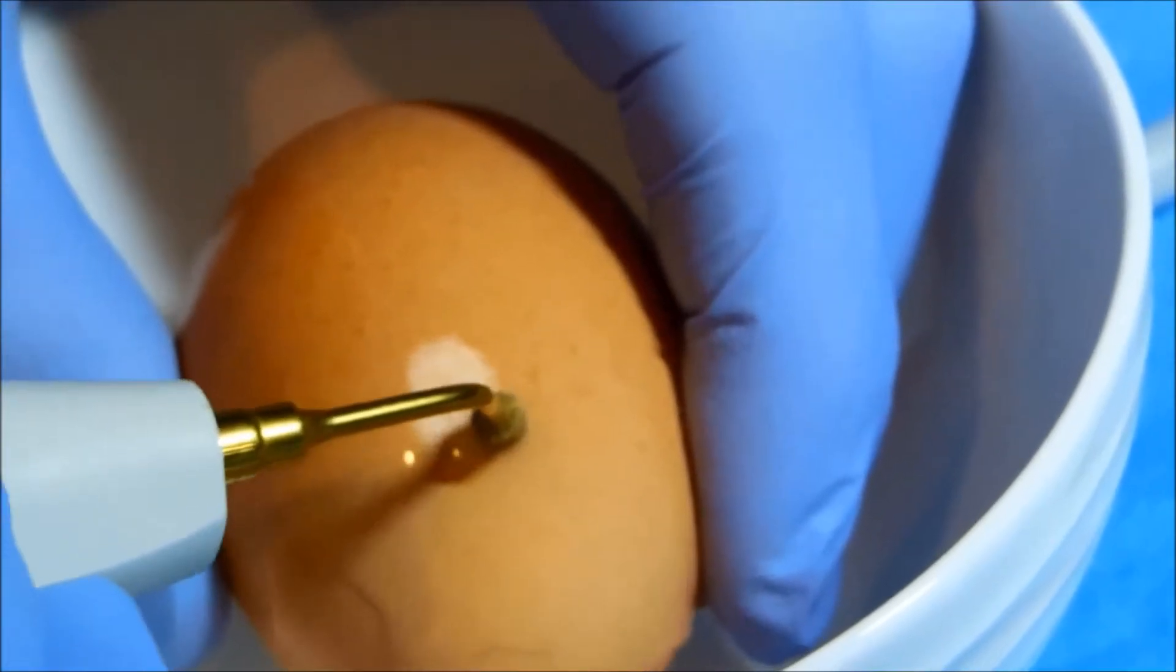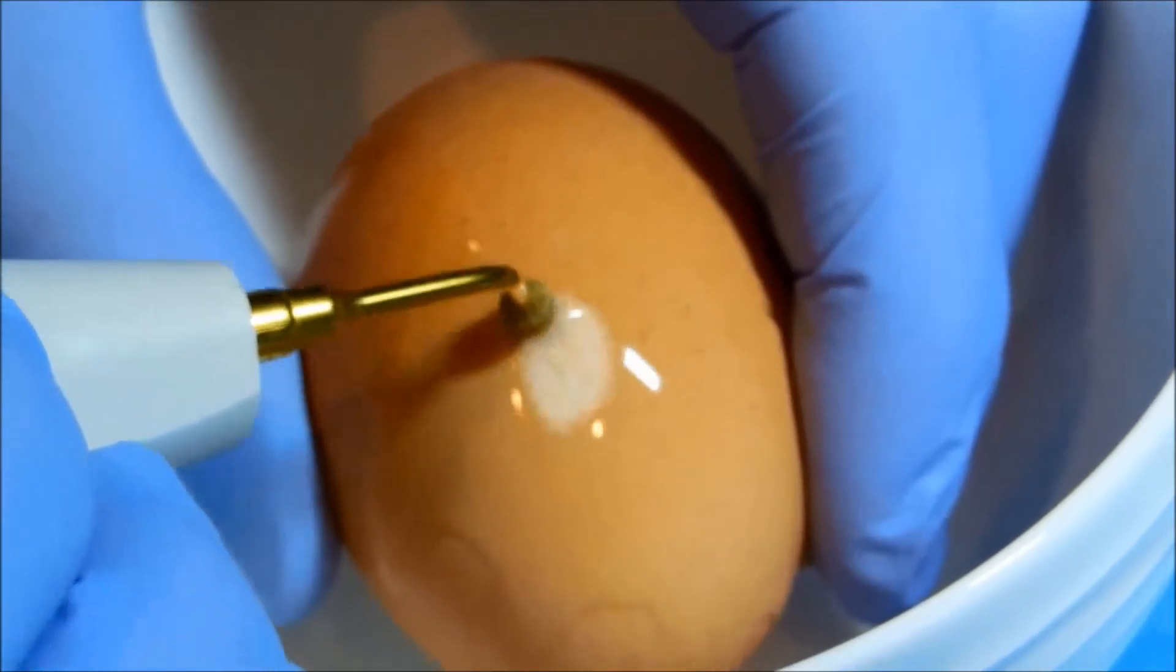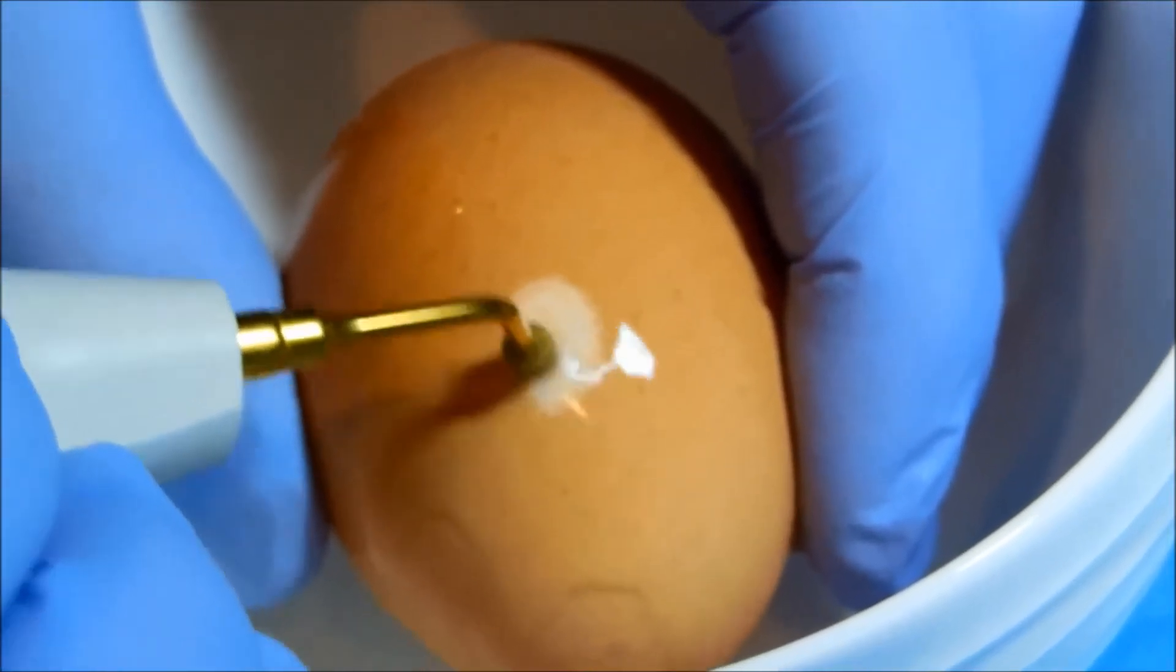This reduces the osteonecrosis that occurs with your typical bone removing burrs.